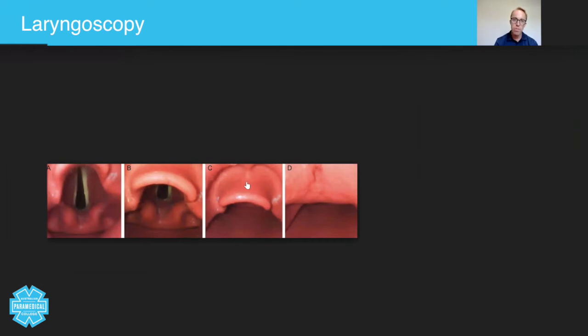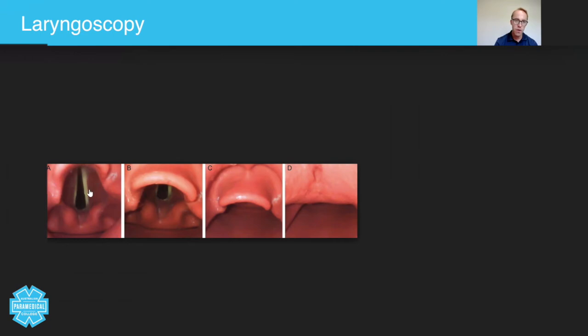And then you use a special type of technique where you displace it up and to the left, which you'll learn in workshop two, to view the vocal cords. And here you can see the vocal cords here. And this is the opening to the trachea.